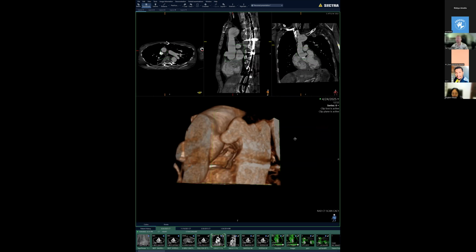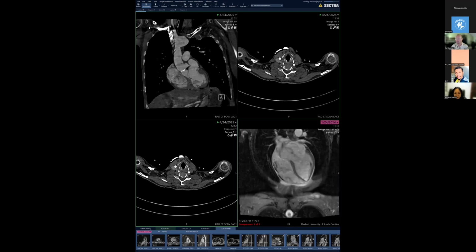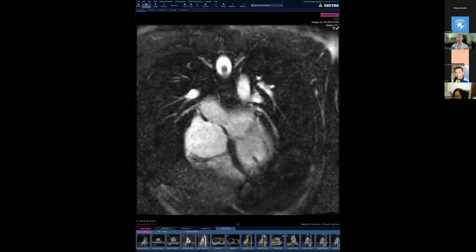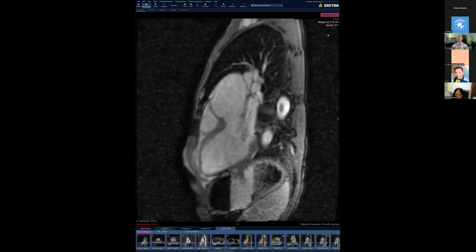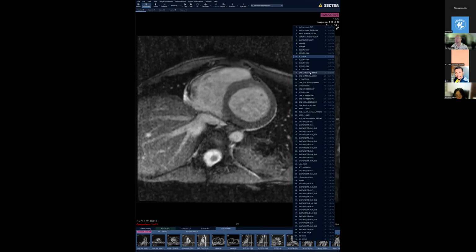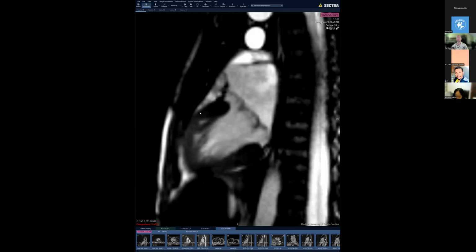All right. And of course, I cannot reiterate enough times that these patients often have mitral prolapse. And you guys are saying, like, this is very boring. He keeps showing us the same thing. Well, that's partly true. And one second. There's a beautiful example of mitral valve prolapse.